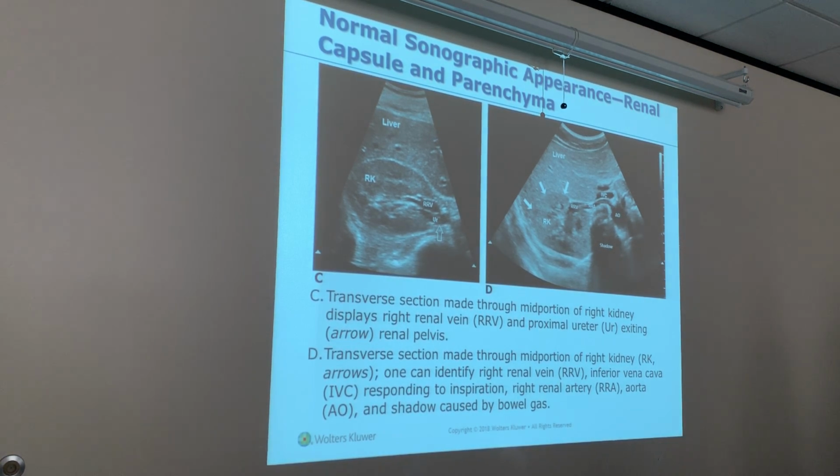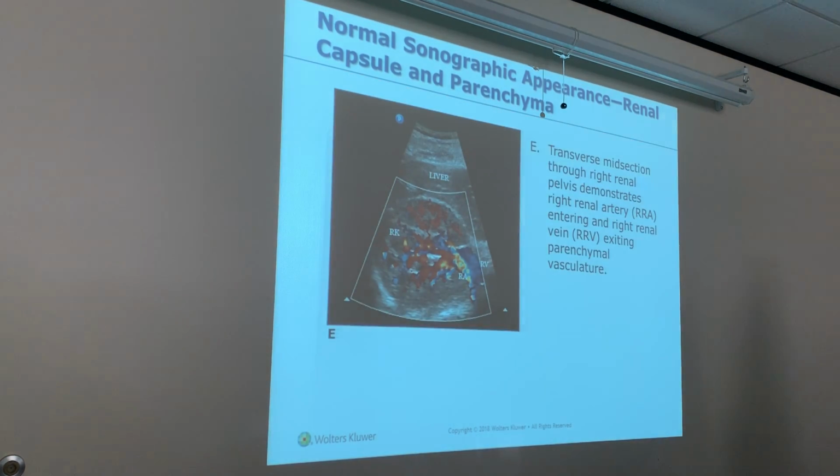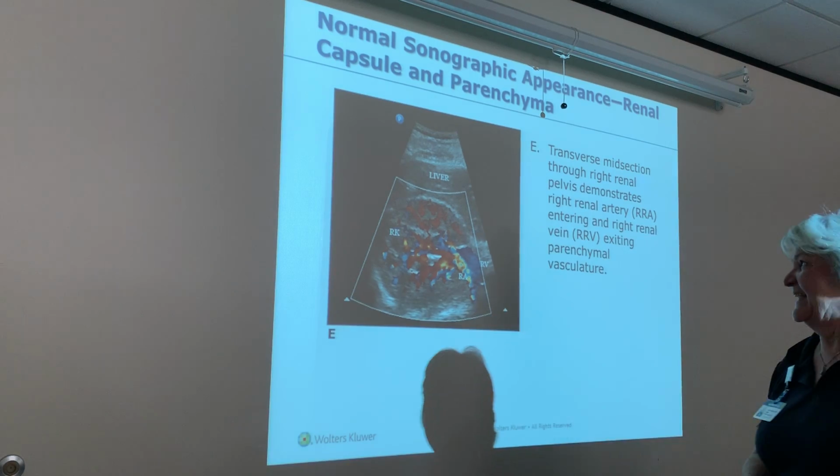Okay? So this one, they have a good machine. They can see everything. You can see everything with a bad machine too, once he's showing the vessels.